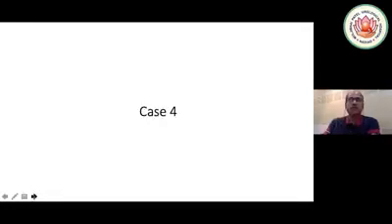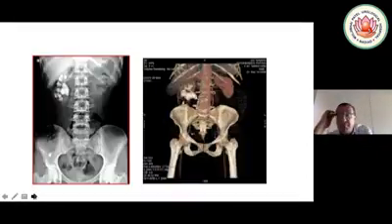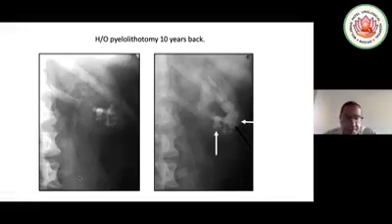Well, coming to the last case, before we take up the questions from the audience, yes, you want to say something, Dr. Gusti? Yeah, that's an important point, that even such a complex PCNL with multiple accesses, if you do the accesses correctly, respecting the anatomy of the kidney, the functional result is always very, very good. And for sure, yes, absolutely. If you are expert, of course, a multi-access PCNL is much more respectful for renal parenchyma than 5 stages of flexible ureteroscopy of 2 hours each.